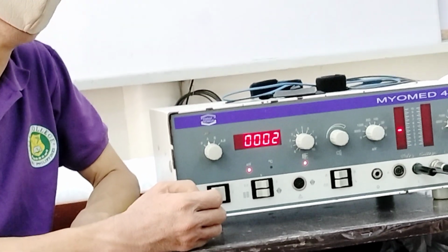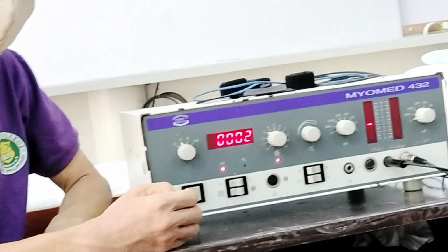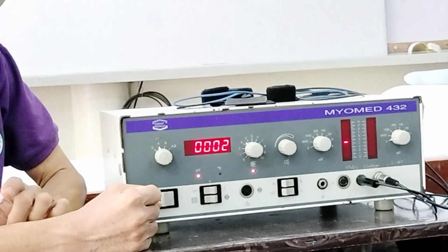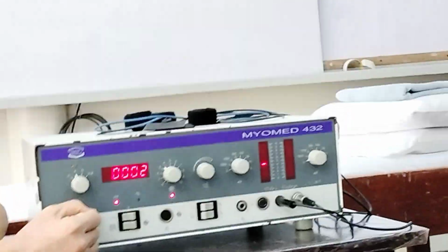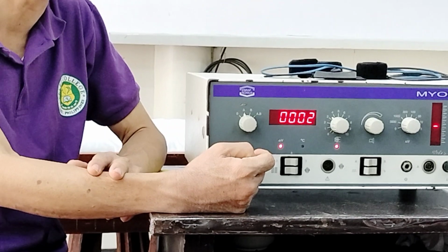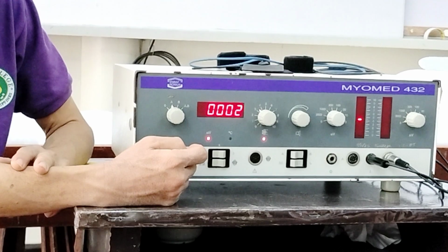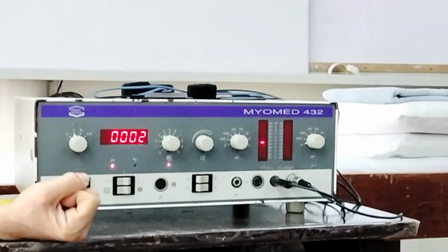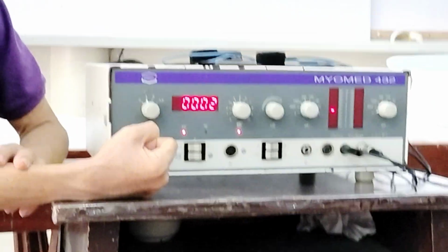Okay. So before you start the training, you first have to assess where the patient's maximum level is if the patient maximally contracts the muscle. The muscle is still relaxed here. So expect that when contracted, the level will increase. You have to first assess and ask the patient, sir, ma'am, try to, for example, flex, try to bend your wrist as much as you can, with a count of 1, 2, 3.